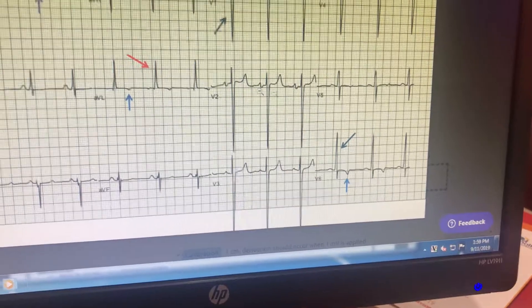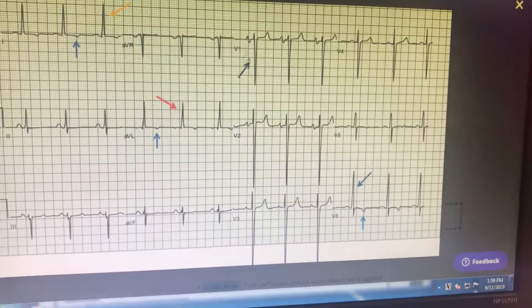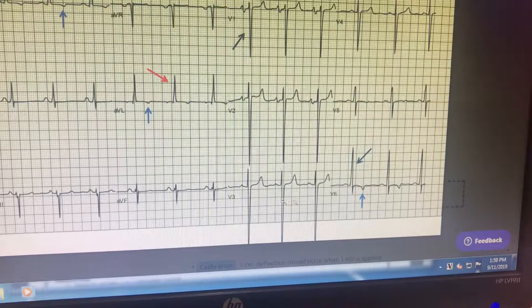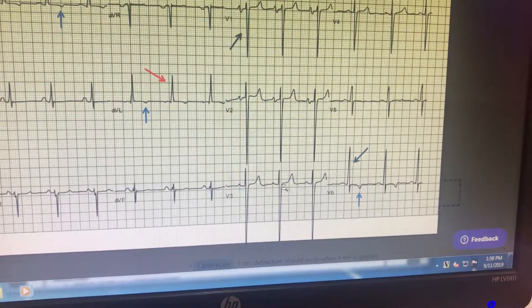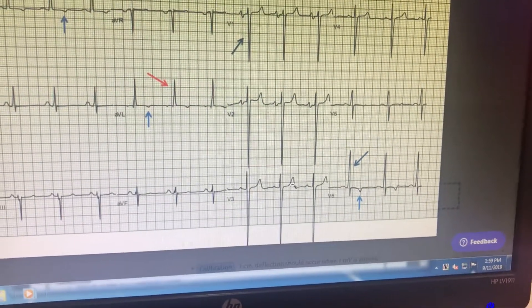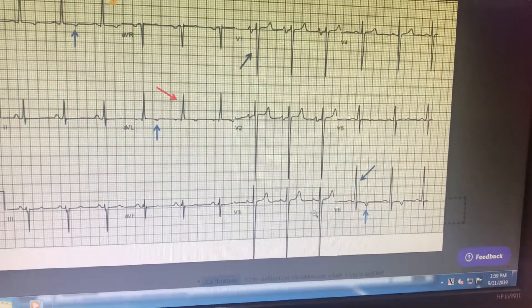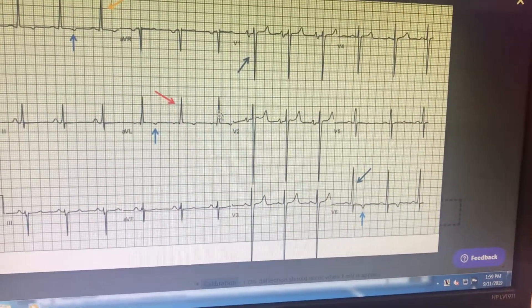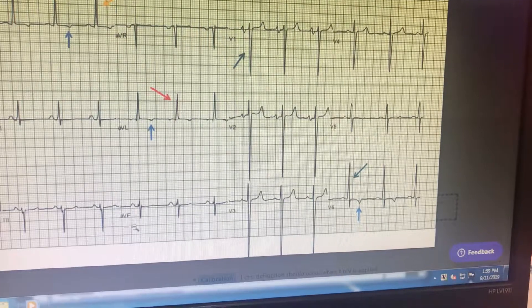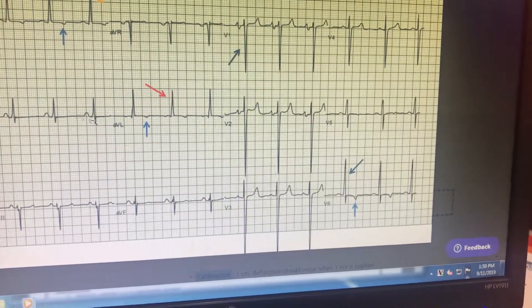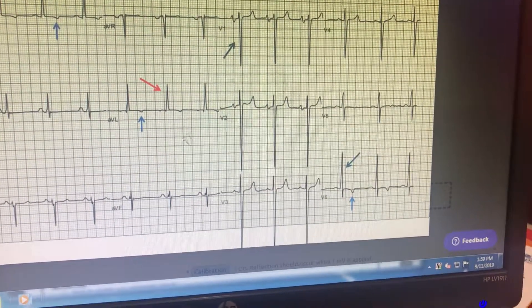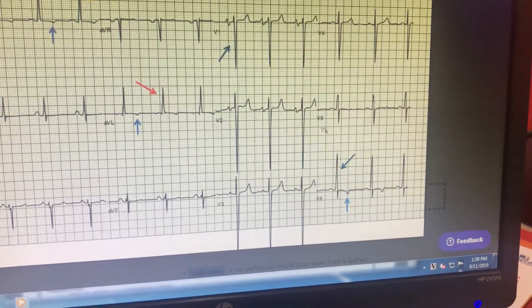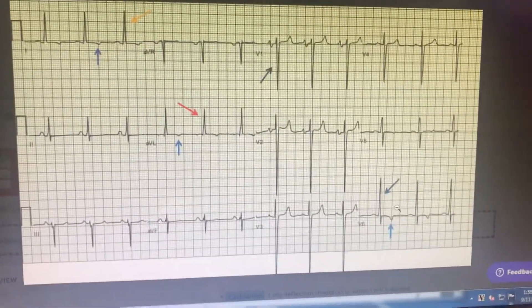So what we can conclude is that there is left atrial enlargement and LV hypertrophy. There are prominent STT wave changes, pointing to LV enlargement as well. The negativity on the right side shows that there is no right axis deviation, no right ventricular enlargement, hypertrophy, or pulmonary hypertension. This overall picture should suggest valvular regurgitation lesions.